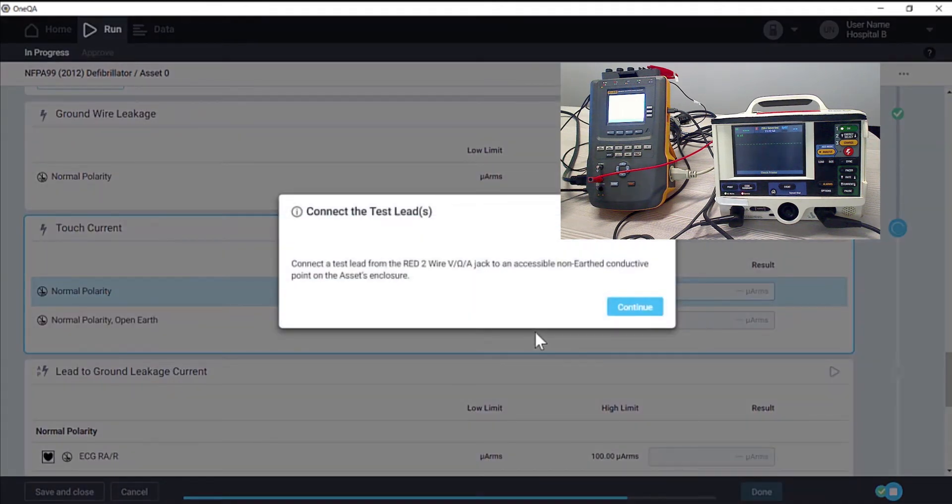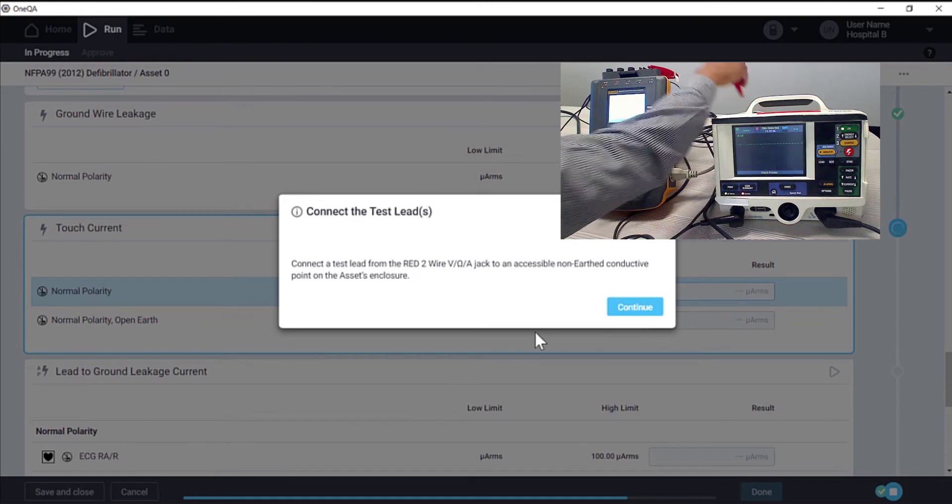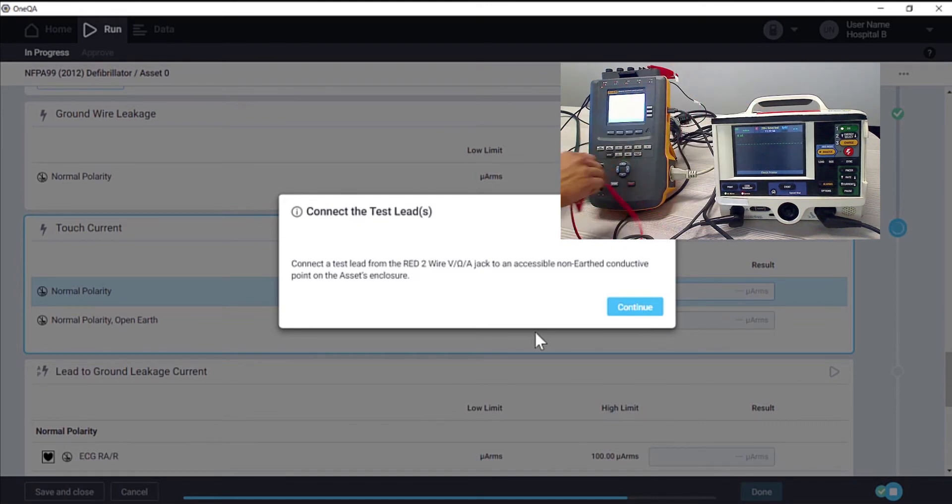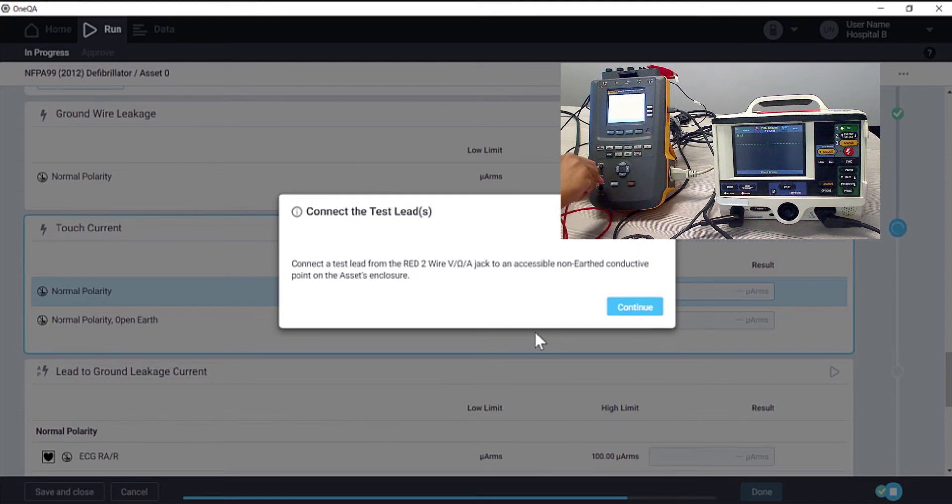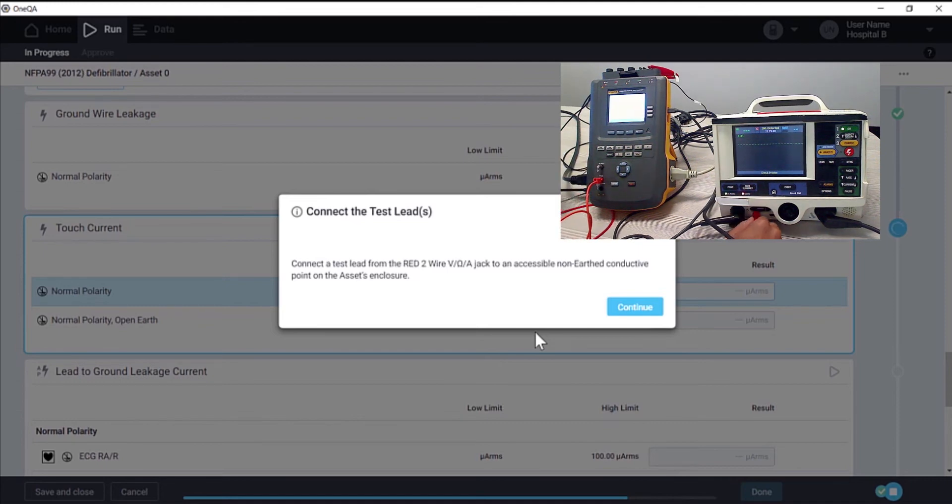We're prompted to reconnect the test lead again. This time to a non-earth point on the enclosure.